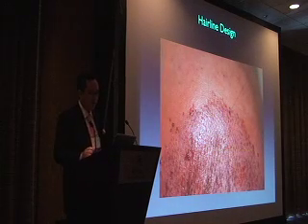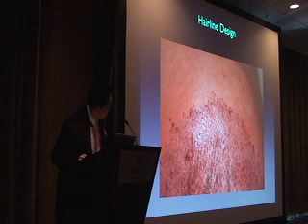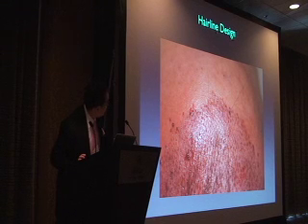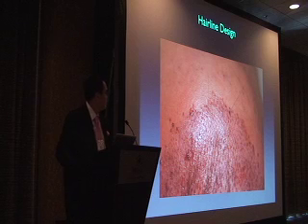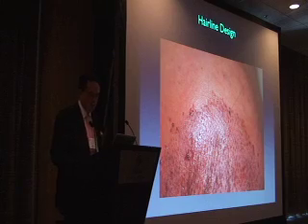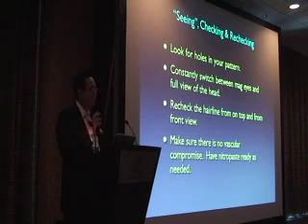So actually this is a great example, because you can see some sentinel hairs that stick out. You can see it's not like this, they're just a little bit jaggedy. And to teach you to see, I'm really glad that if you look, there's a little hole here. This photo was taken before I went and touched it up, but I would go back and put one site there. So your eyes want to be looking for holes, looking for little patterns. And the more you do, and that's what we're going to do in St. Louis, you'll make a pattern, I'll look at it, I'll show you the defects, and they're too close, too wide, the angles are bad. That way you get some visual feedback. So seeing: the more you do, the more you see, and you're looking for those holes in the design. You're looking for areas too tight.